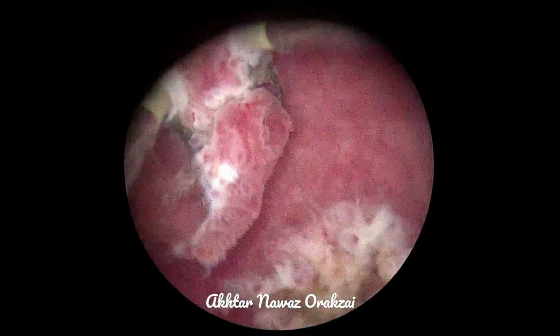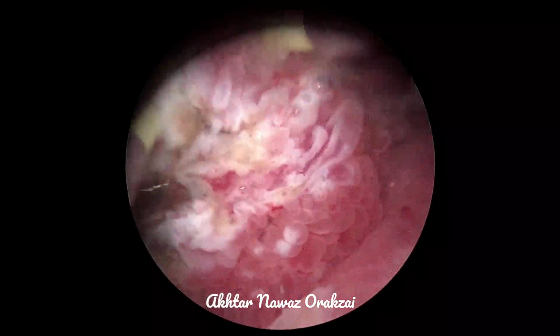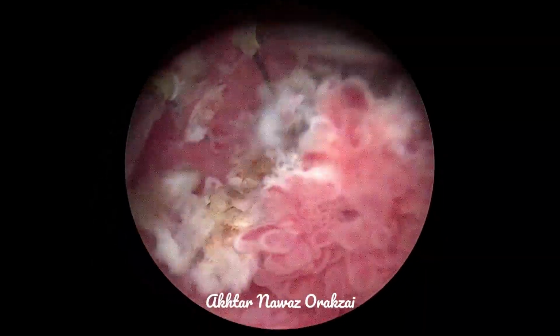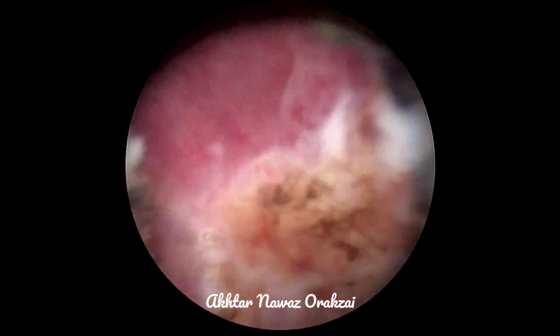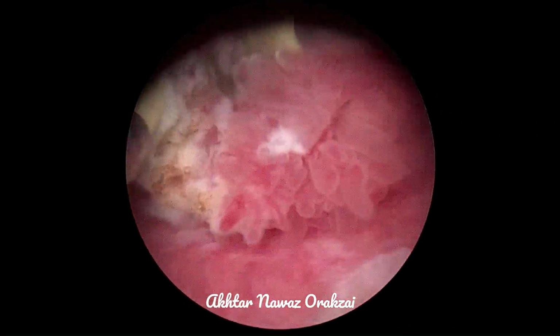So here you can see that we are resecting the bladder tumor in a fashion which is called resection in fractions, not in total. We are encountering bleeding in the base. Care must be taken not to go too deep in such cases.